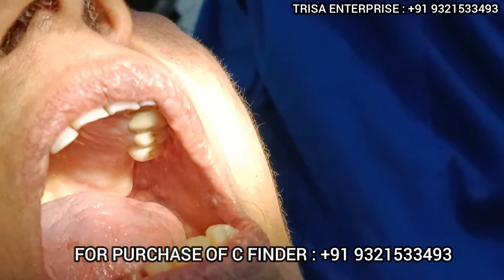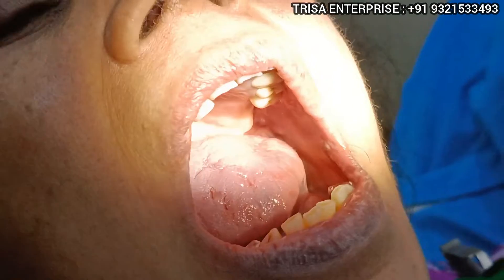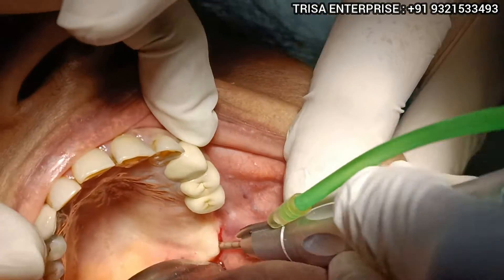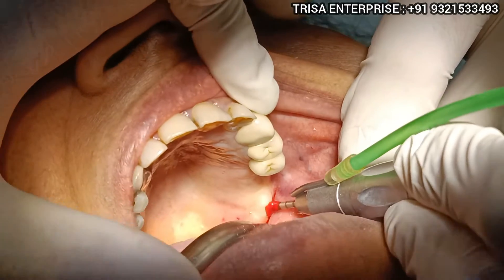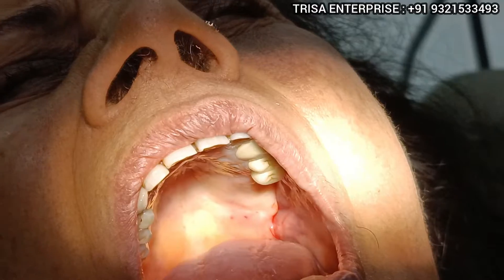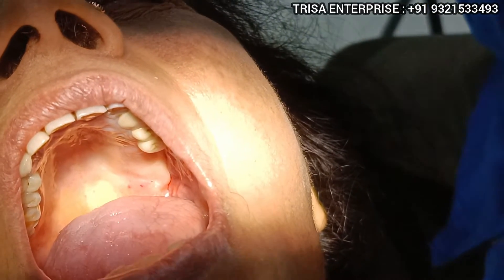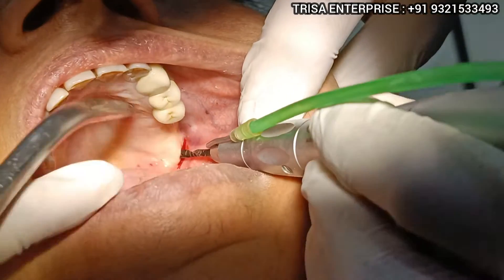The speed will be around 3000 RPM at least. Very, very soft quality bone, as expected. Next I will be using my 2.0 drill, and most likely that will be my last drill for a 4.0 implant.